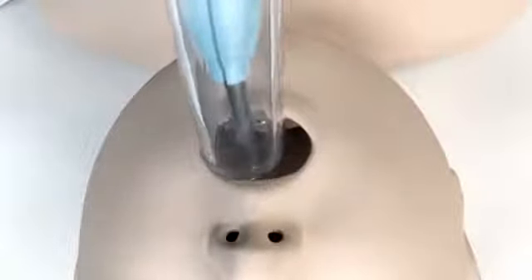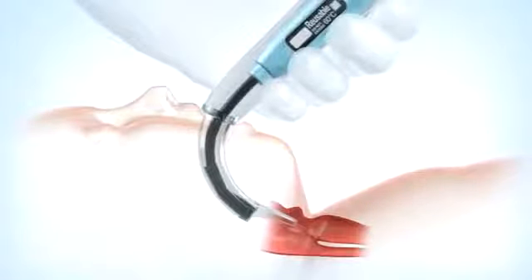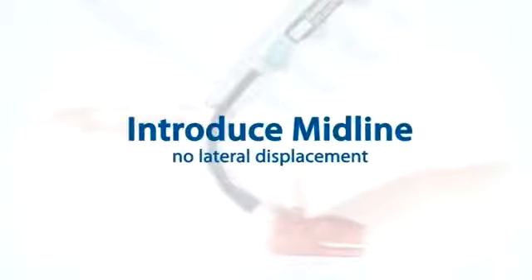Gently advance the GlideScope until the tip of the laryngoscope is past the posterior portion of the tongue. Then apply a slight lift. Unlike conventional laryngoscopy, the GlideScope video laryngoscope is introduced midline. No lateral displacement of the tongue is required.